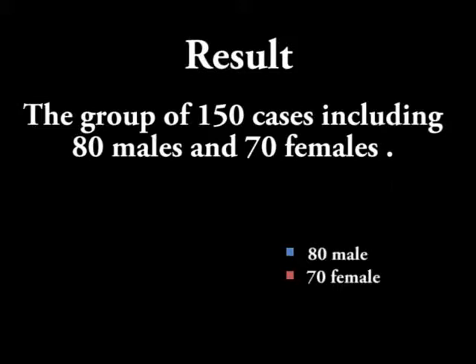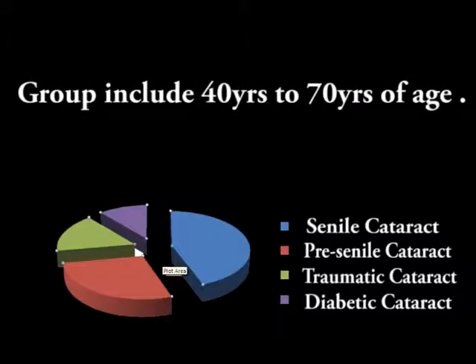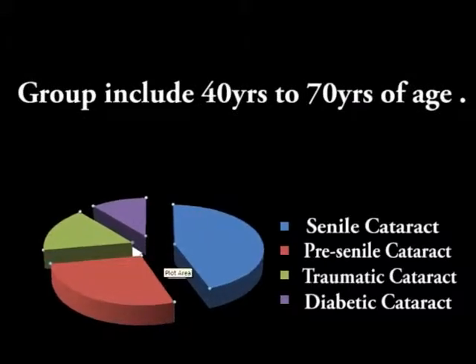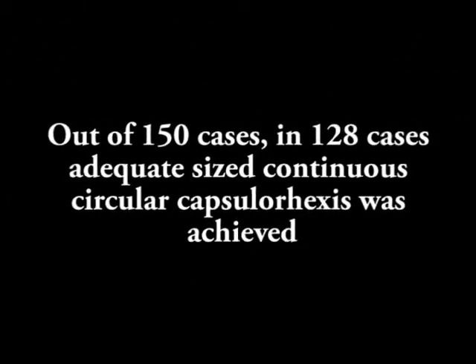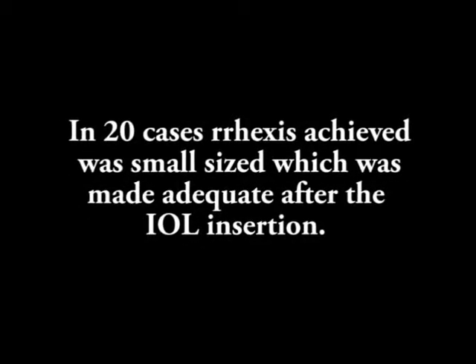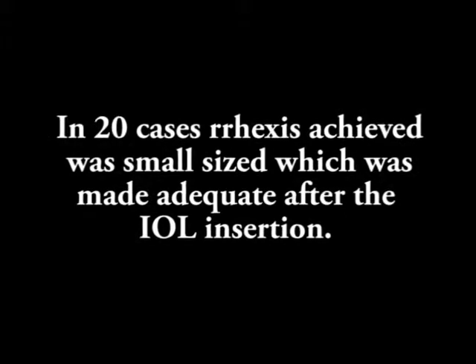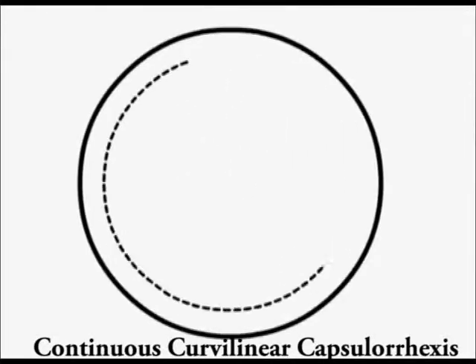So a group of 150 cases, including 80 males and 70 females, were subjected. This group included patients between 40 and 70 years, predominantly senile cataracts. Out of the 150 cases, in 128 cases, adequate sized continuous rhexis was achieved. In 20 cases, the rhexis achieved was small sized, which was subsequently increased after the IOL insertion. As you can see here, this is the continuous curvilinear capsular rhexis.